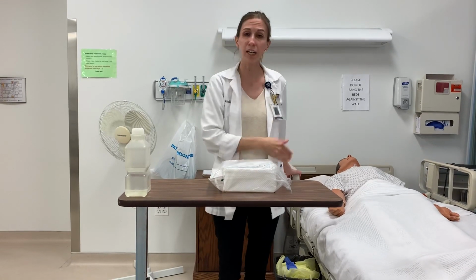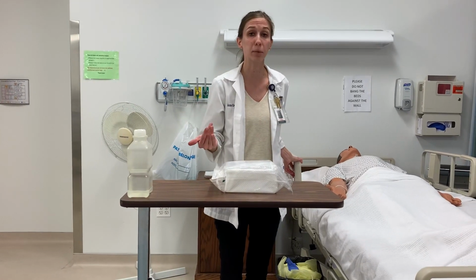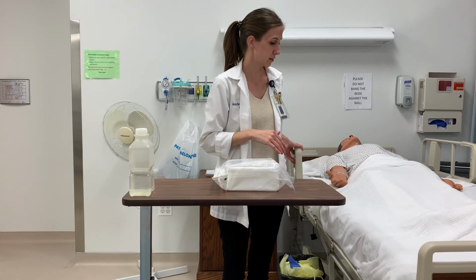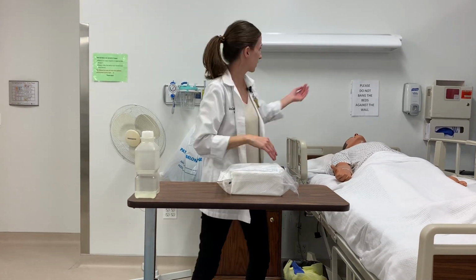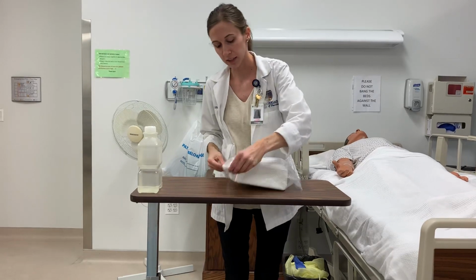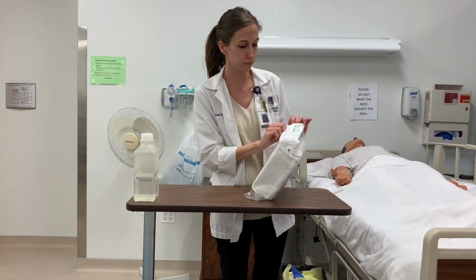Of course, I'd be doing any introductions and hand hygiene upon entering the room. This is just to show you the principles of sterility to keep in mind. Okay, so I'll have them up at my waist. I would do hand hygiene, again, one more time before working with this kit. So again, I've checked the label. I'm going to undo the seal here.